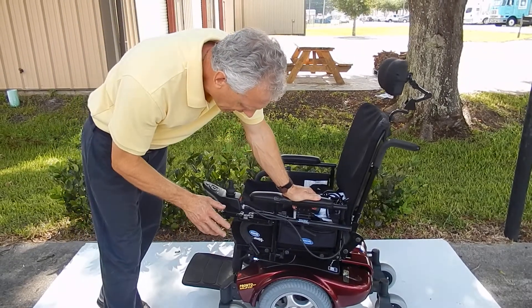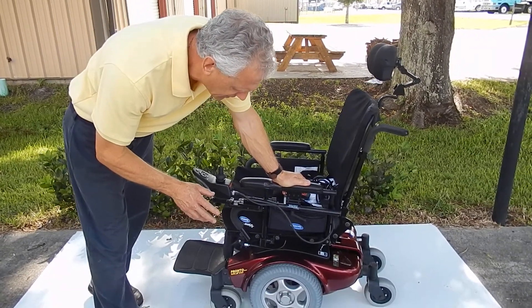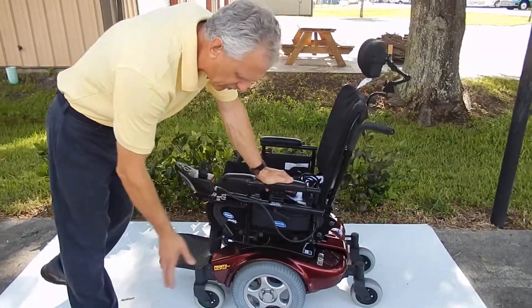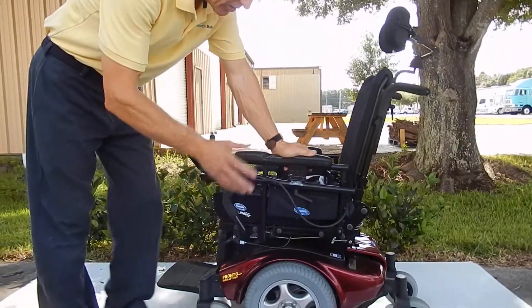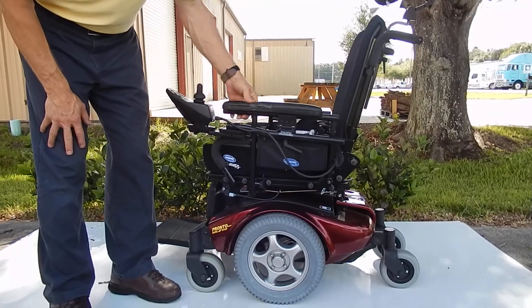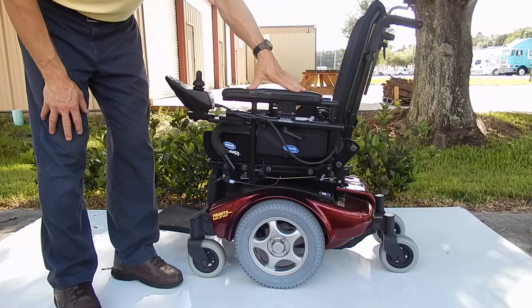This is a Pronto M91 power chair, practically in brand new condition, as you can tell by the tires. All the tires are original in this chair. The only thing I've noticed on the chair, it does have a little scar on the side of the arm. We will replace this little pad arm, which is no big deal, so it'll be replaced.